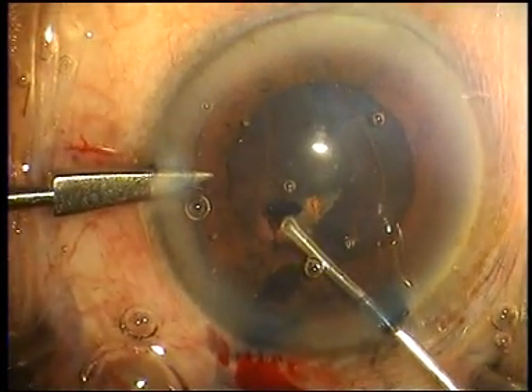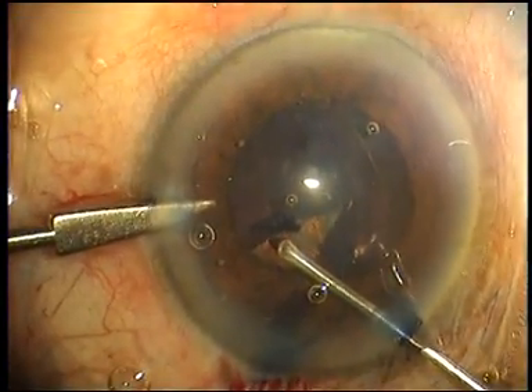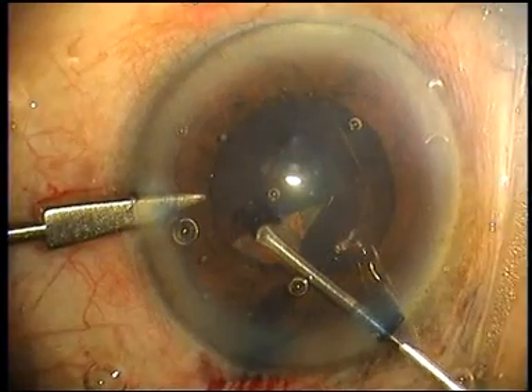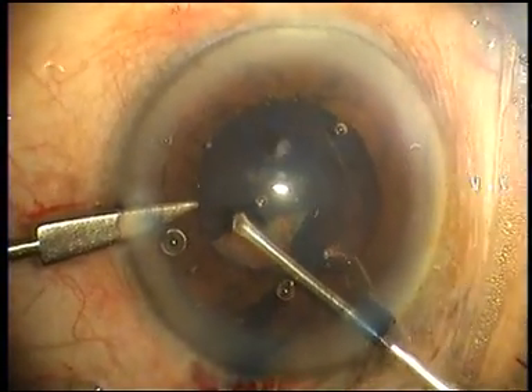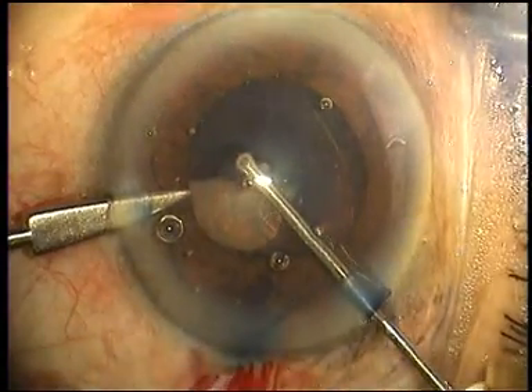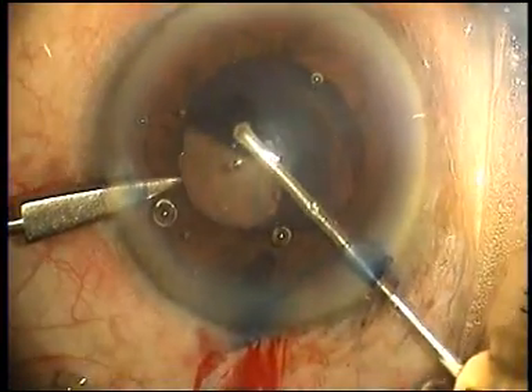The Banaji eye lock is both a globe stabilizer as well as a phaco chopper — it's a double-ended instrument. The eye lock keeps the eye in position whilst the rhexis is performed.